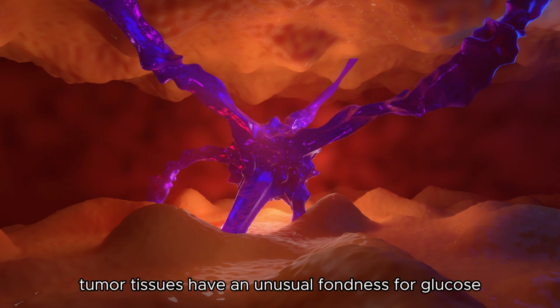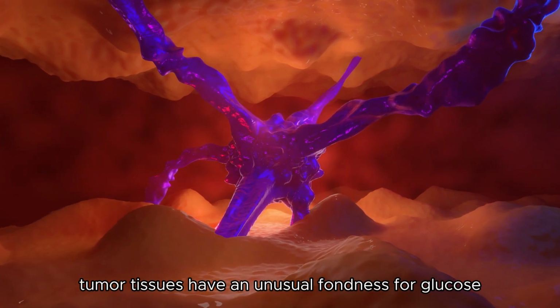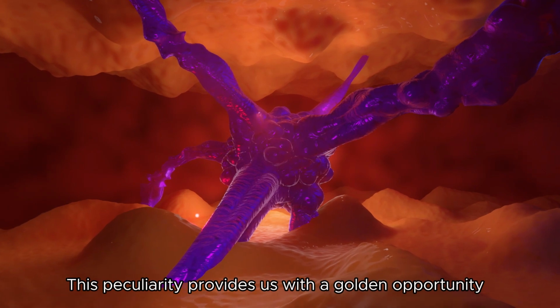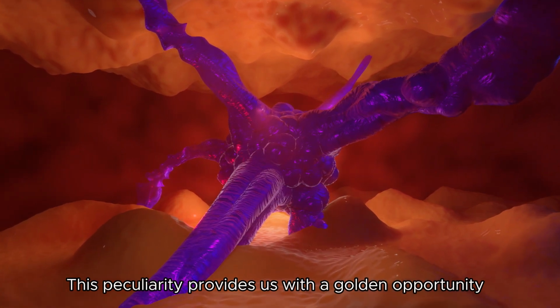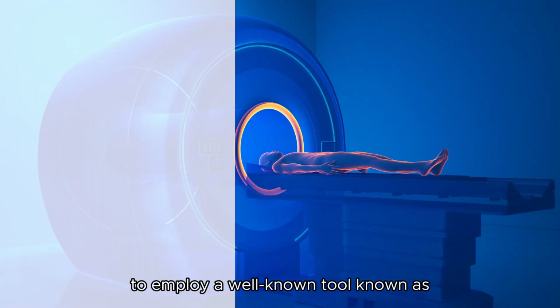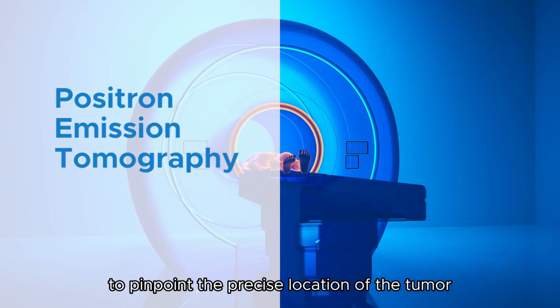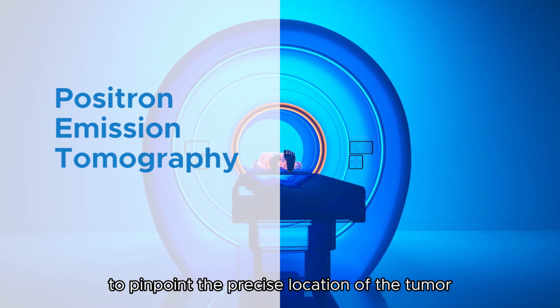Turns out tumor tissues have an unusual fondness for glucose, a phenomenon referred to as the Warburg effect. This peculiarity provides us with a golden opportunity to employ a well-known tool known as Positron Emission Tomography, or PET for short, to pinpoint the precise location of the tumor.